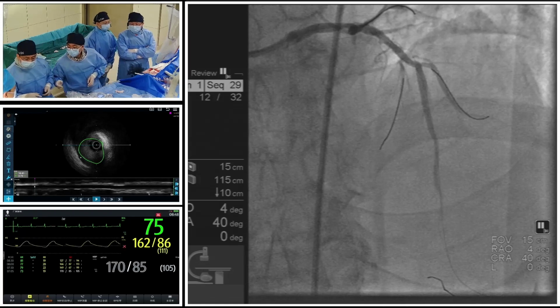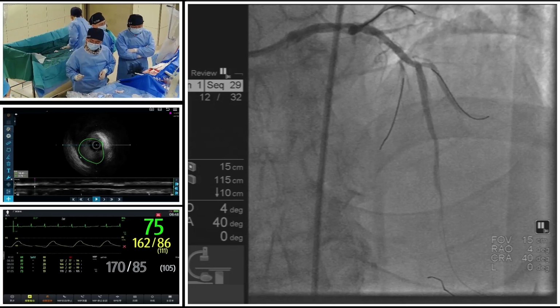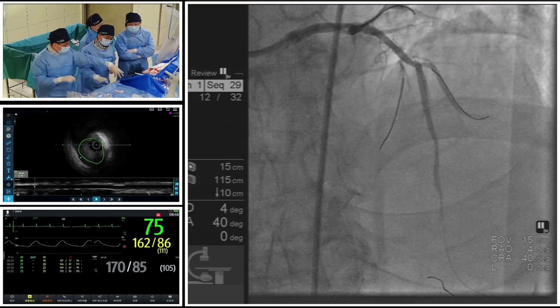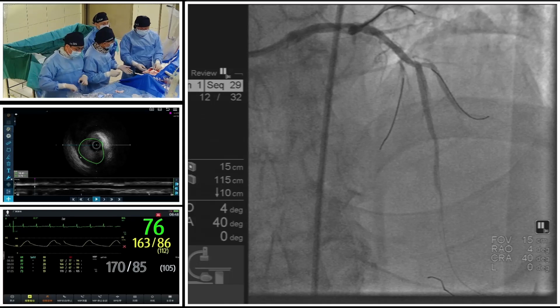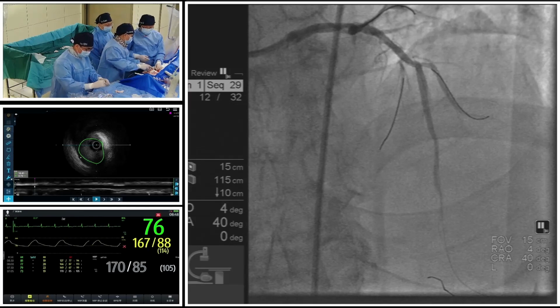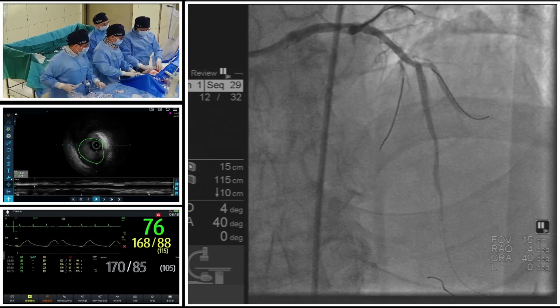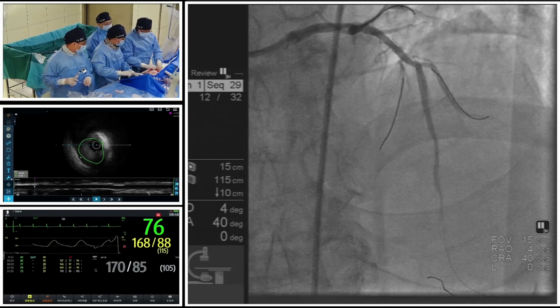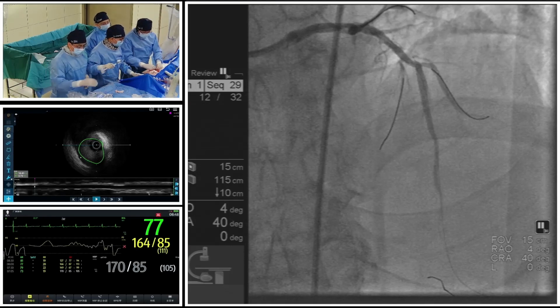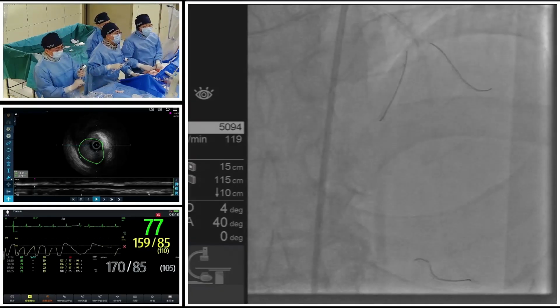The audience wonders about the necessity and the importance of this wire in the septal. I think this is of great importance for this patient because you can see that there is one big and isolated septal, so keeping its patency is of great importance. Sometimes the loss of a septal of this size can in fact influence the heart function of the patient, not to mention angina after the procedure.